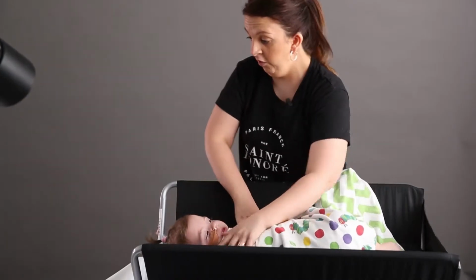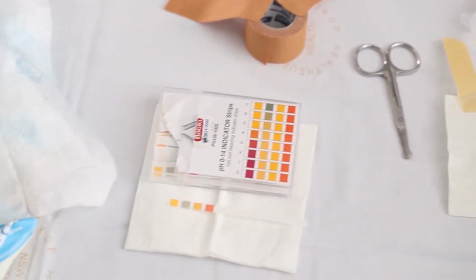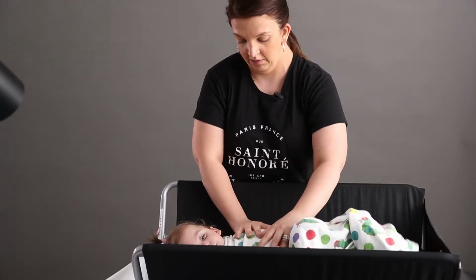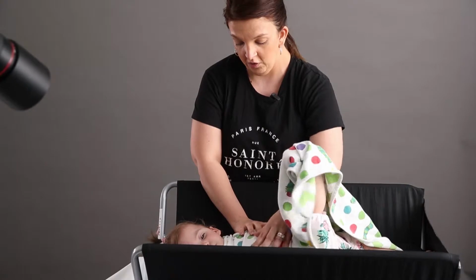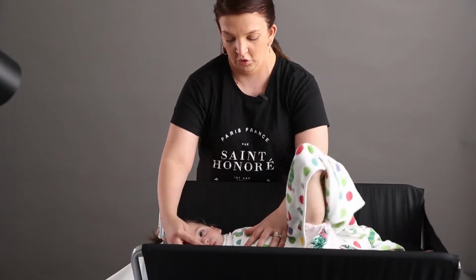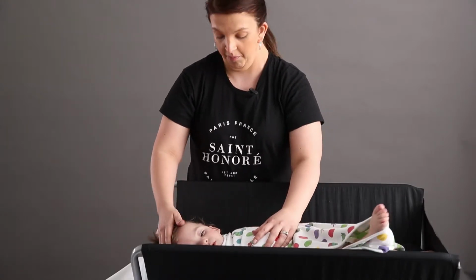Before we get started, you really want to prep everything so it's there, it's handy, and it's just boom, boom, boom as you go. So I first started with wrapping Emily up because I don't want her hands and whatnot to get in the way of us starting, because once we start we really need to hold the tube so it doesn't move at all, and then it's easy for us to tape up.